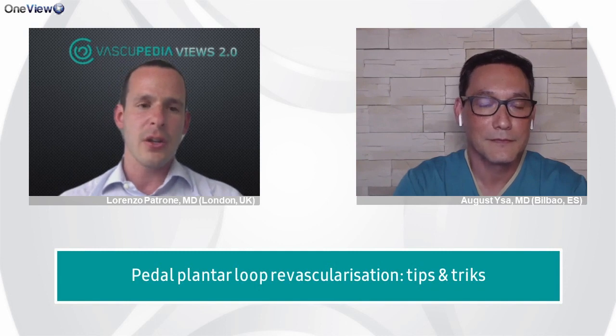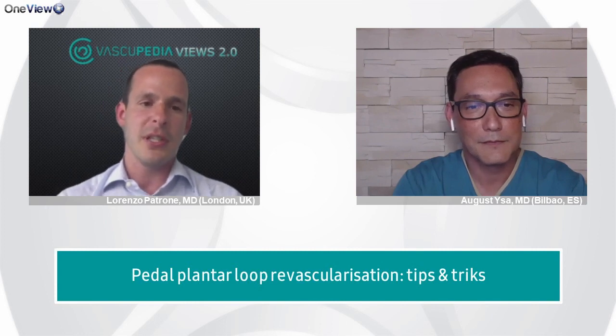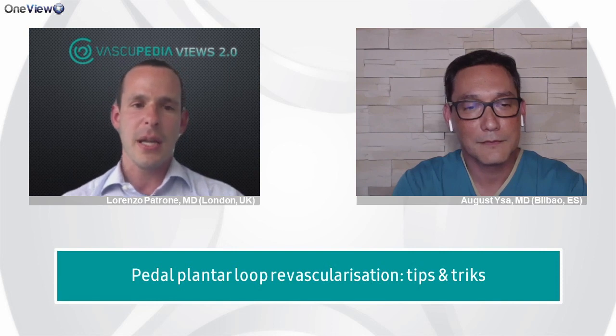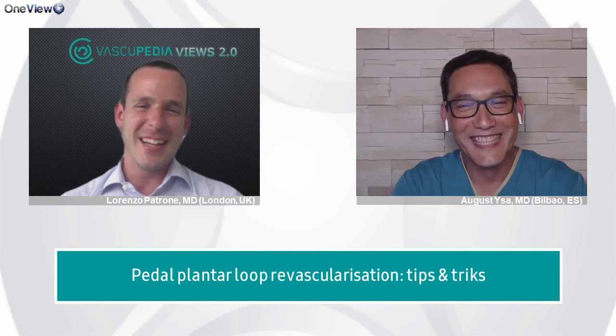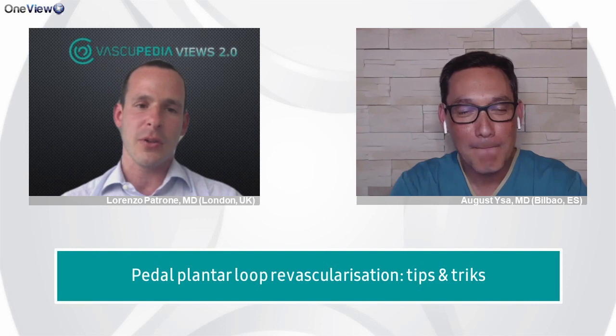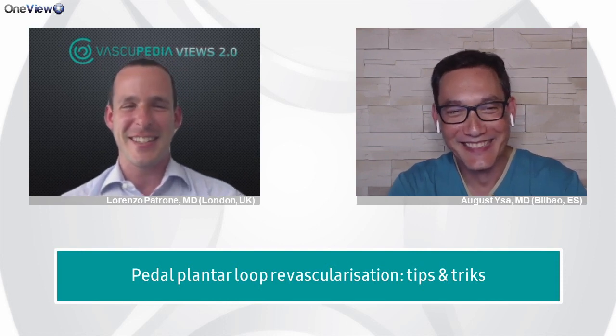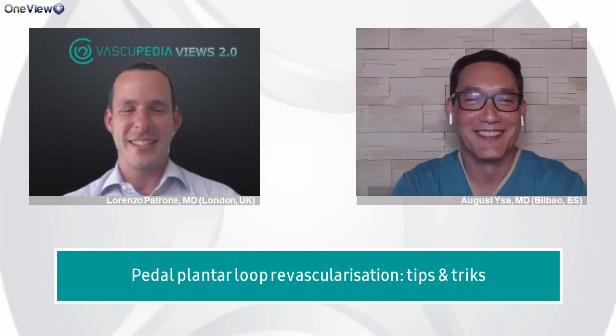And actually, what I learned is the popliteal block, where you just go around the fascia of the nerve at the level of the popliteal fossa. You puncture, let's say, 2 centimeters above the ligament, and you go into the nerve. This has to be done under ultrasound, not under fluoroscopic guidance. And you inject in the fascia, and actually in 20 minutes, the whole leg is numb. It's nice to do it before, when you consent the patient, and as soon as you consent, you stick the needle inside the nerve, and you have this good effect.